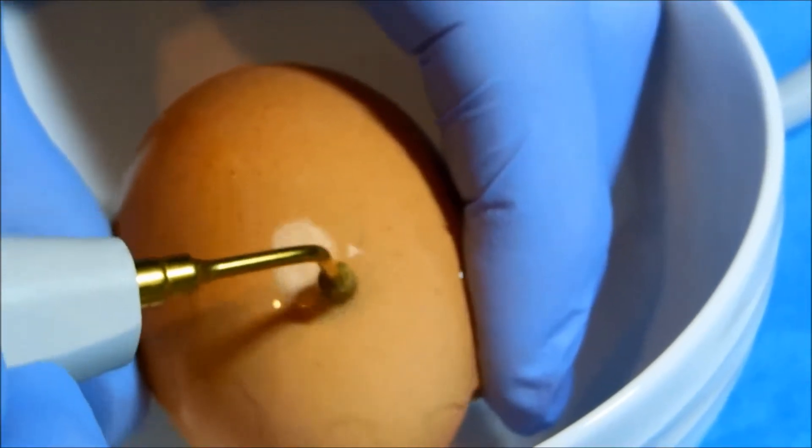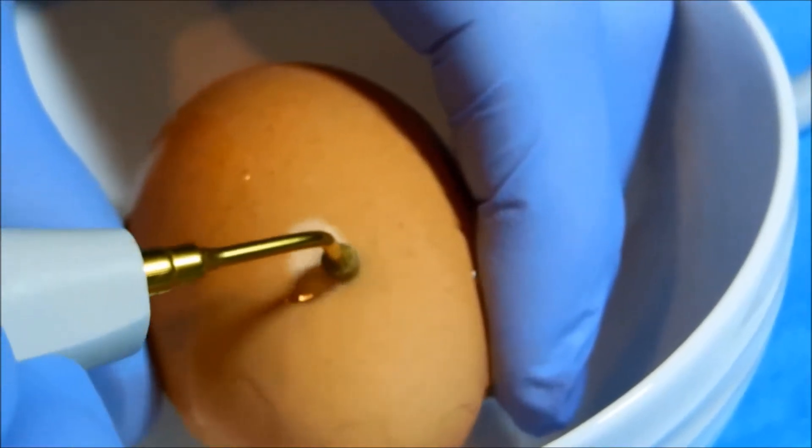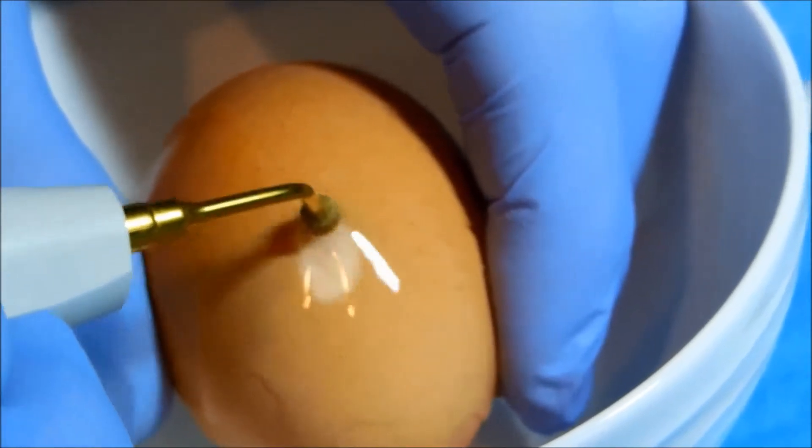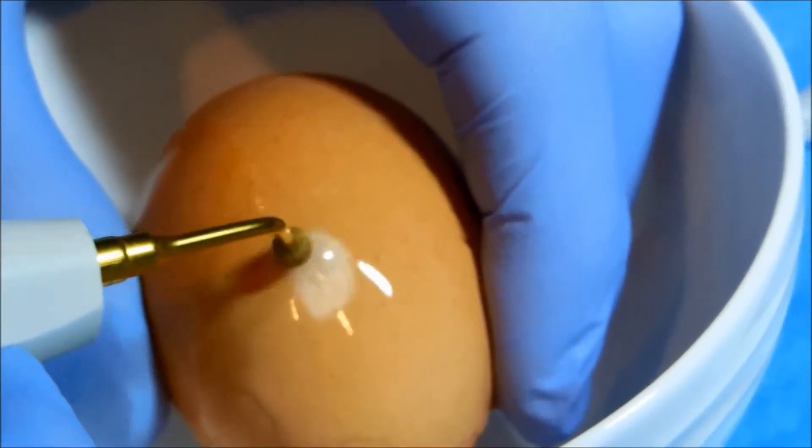One of the most important features also of the piezo surgery machine is that it's internally irrigated through every tip. So there's virtually no heat going to the bone.